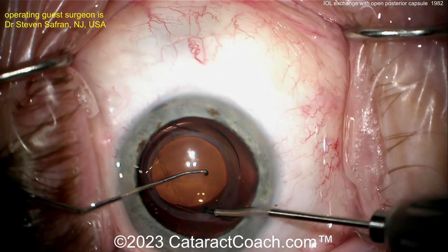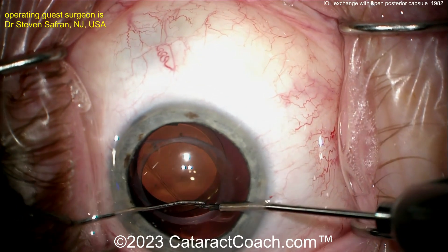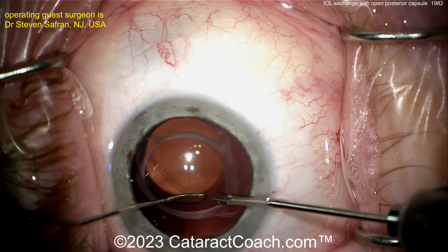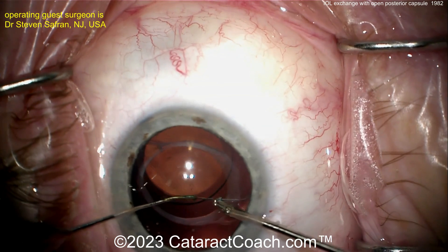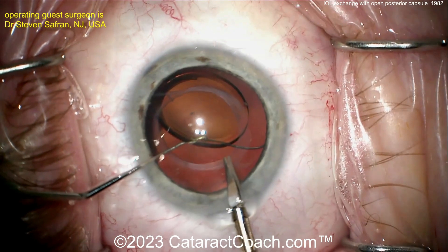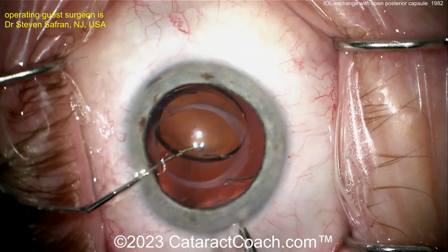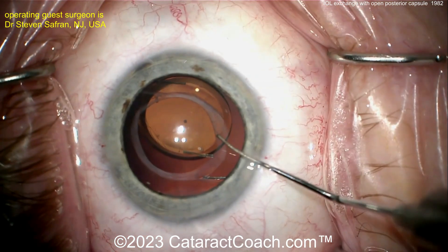At this point the surgeon is trying to bring the lens up out of the bag, but one haptic is just stuck in place — he can't quite get the right leverage to bring it up. He doesn't want to do too much manipulation and risk vitreous prolapse, so he's going to amputate that one haptic. Don't worry — he'll come back and remove it.